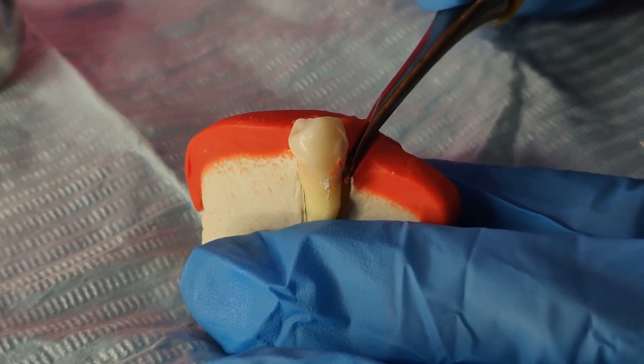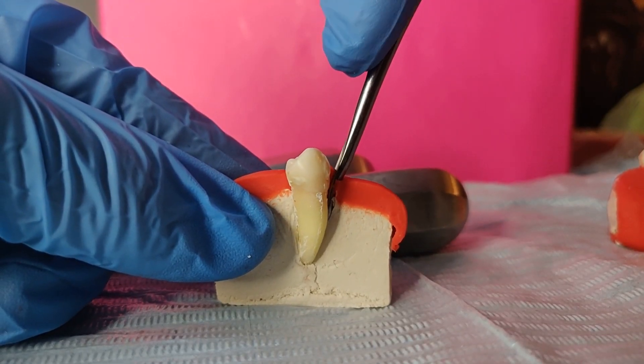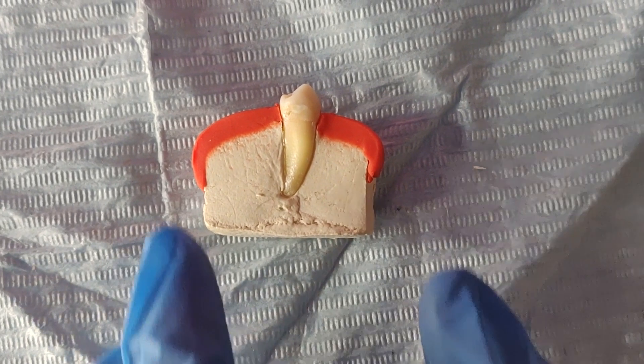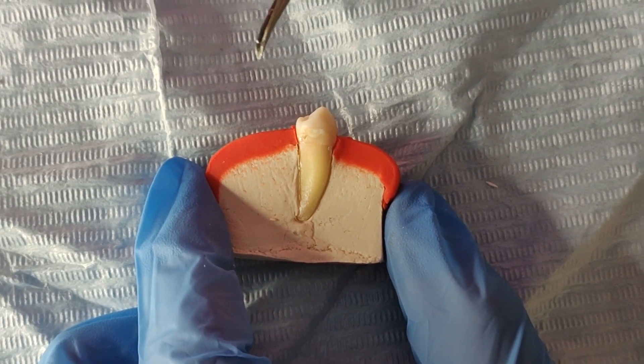In this cross section of the bone and the gingiva you can notice the wedge principle. A straight elevator is used to luxate a tooth from its socket. A small elevator is wedged into the periodontal ligament space which displaces the root or the tooth toward the occlusion and thus out of the socket.